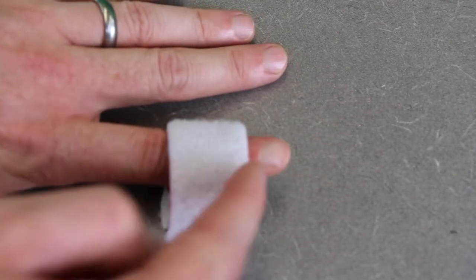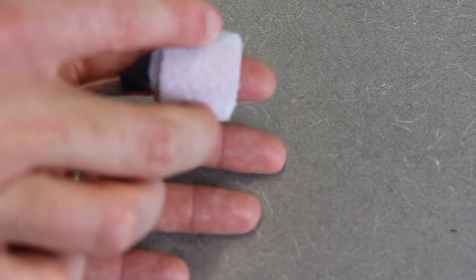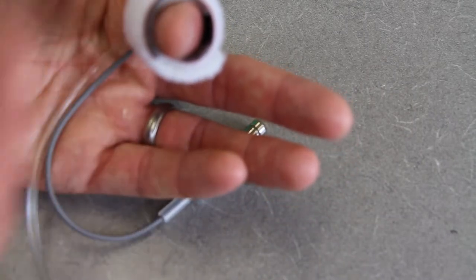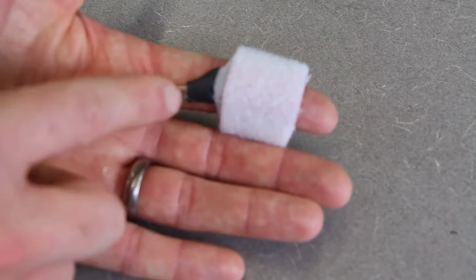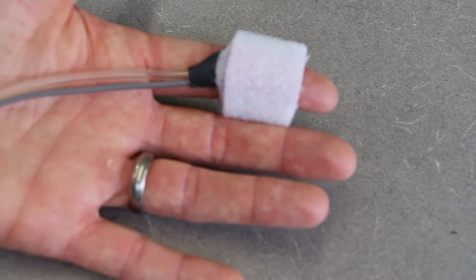Put the cuff above the middle knuckle and below the top knuckle, and get it on nice and tight. Those two black sensors need to be on either side of the finger so it can sense across the tissue on the bottom of the finger. Another way to confirm correct placement: as long as the size is correct, the tubing should be coming out on the underside of the finger.